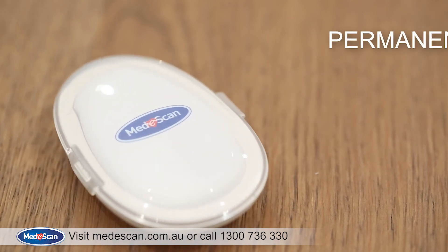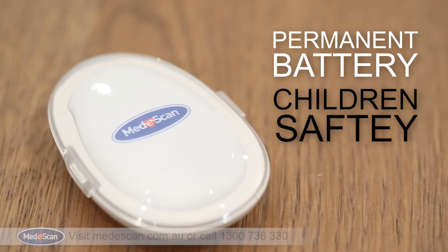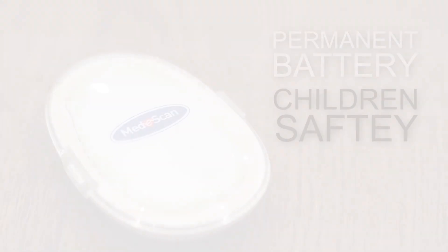The SmartScan thermometer has a permanent battery to ensure children's safety and to comply with Australia's latest battery safety regulations. We hope you've found this video helpful. For more information, visit www.mediscan.com.au or contact our customer service team on 1300 736 330.